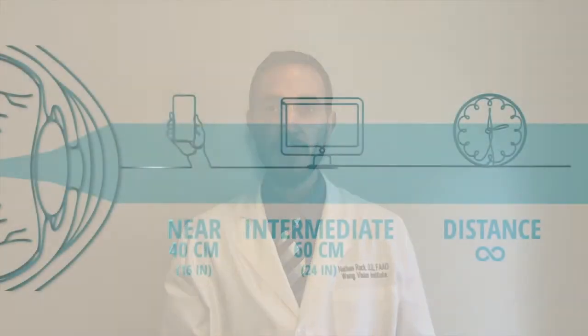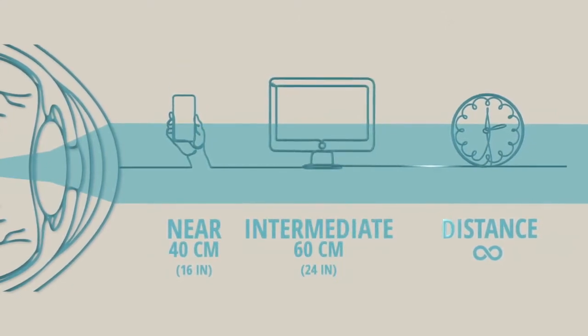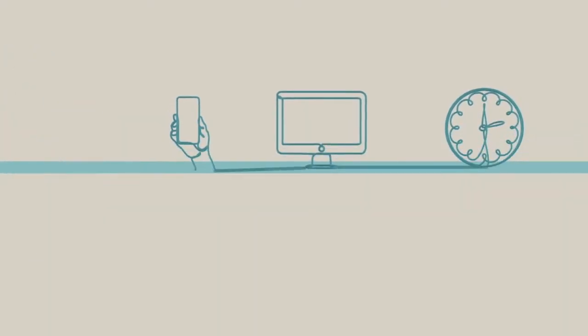So the good thing about the multifocal is that it does allow a full range of vision correction at multiple distances. The downsides are that reading glasses will still be necessary for small print and for low light. Extra light is necessary in low light situations, and then halos and rings around lights are a permanent, though mild for most patients, side effect of the lenses. Overall, though, the vast majority of patients who do have vision correction with a multifocal lens are very pleased with the results after the body has had time to adjust to the lens implant.